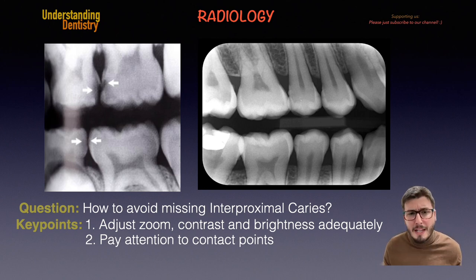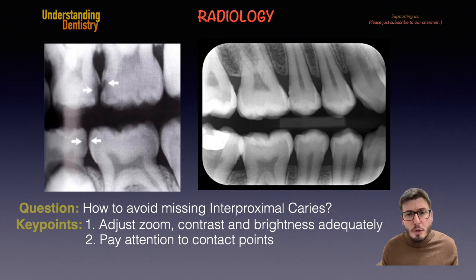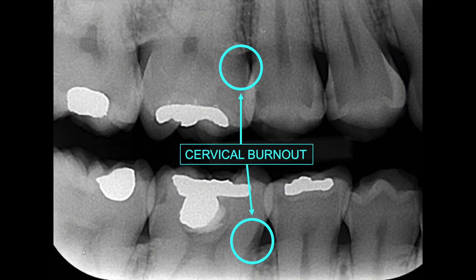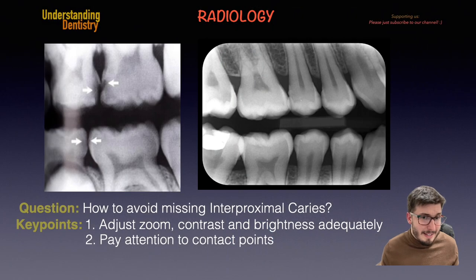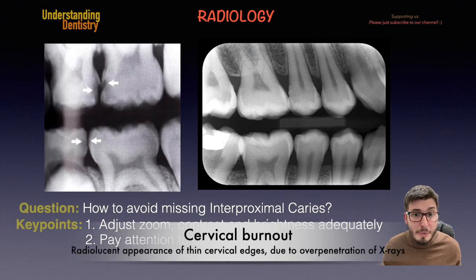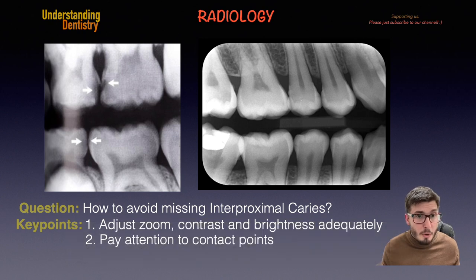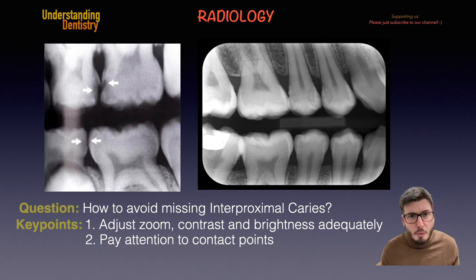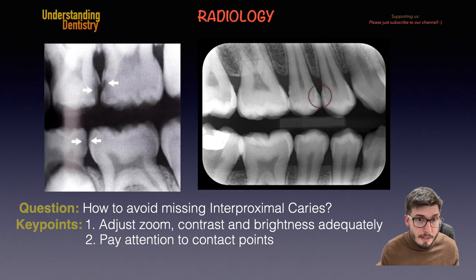Pay attention to the contact points. Usually the radiolucencies we see on the cervical side of the tooth, close to the alveolar crest and the CEJ, are cervical burnouts. Caries will likely happen on the contact points — that's something we need to remember. We are now seeing those initial caries as examples.